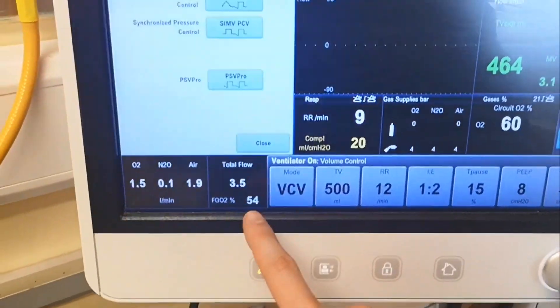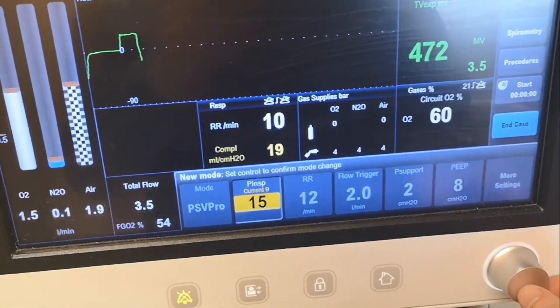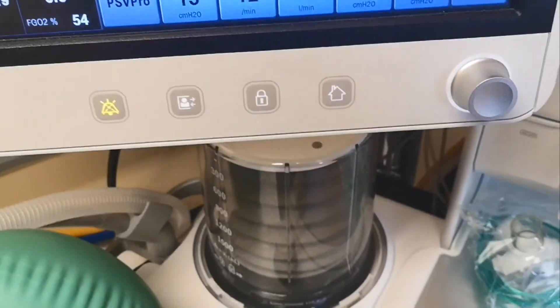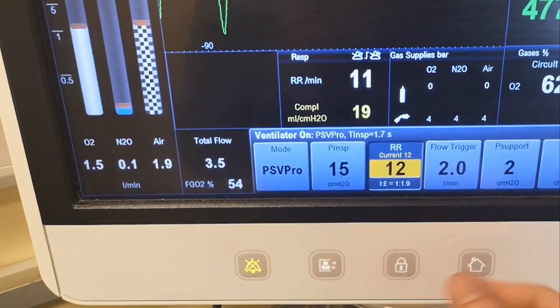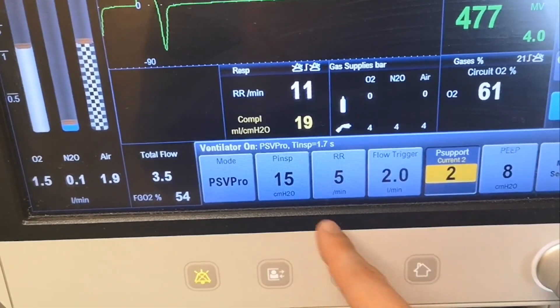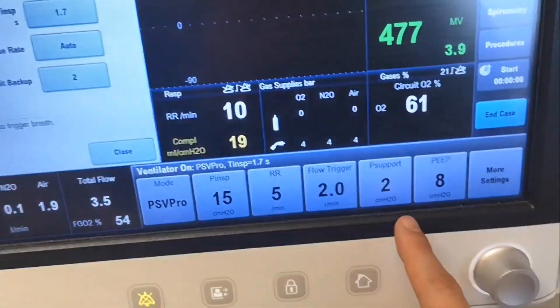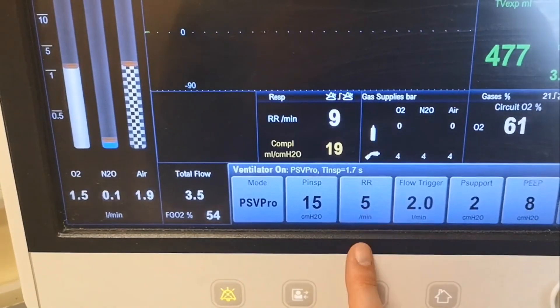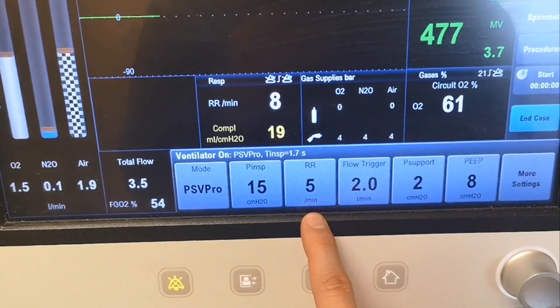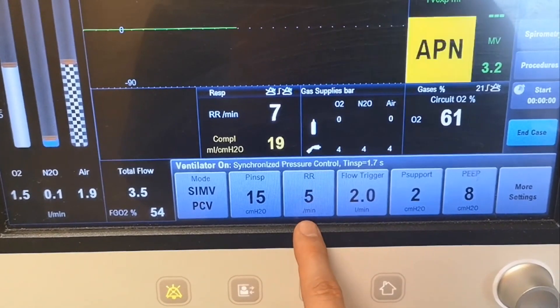Let's change the modality to PSV Pro because the patient has started breathing. Set an inspiration pressure of 15 and a respiratory rate of 12. This modality is slightly different from the previous one — because it gives you a backup rate. If the patient does not breathe, the machine will start breathing with these settings.